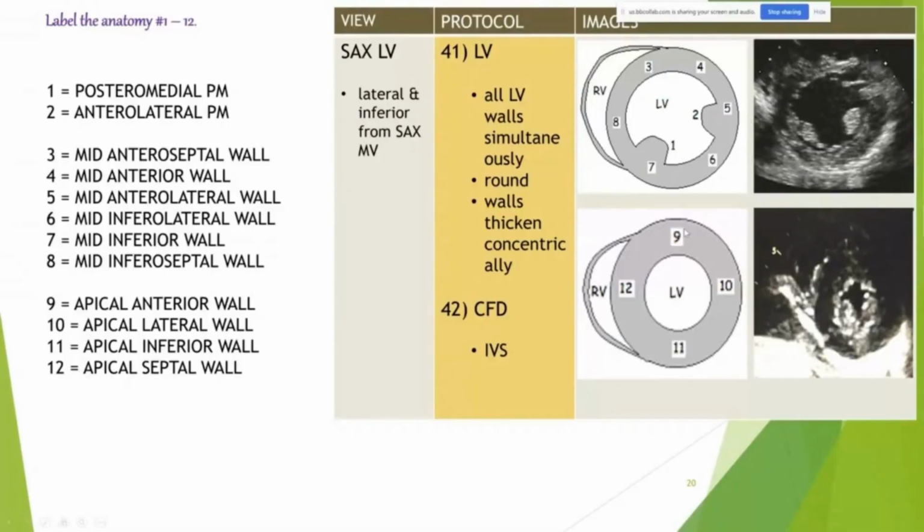So you would say apical anterior wall. Remember I told you anti late in September, right? Are we following? Yes. Okay, so apical anterior wall will be right here. So anti stands for anterior, late is for lateral, in stands for inferior. You know, September is the septal wall. That's how I remember it.